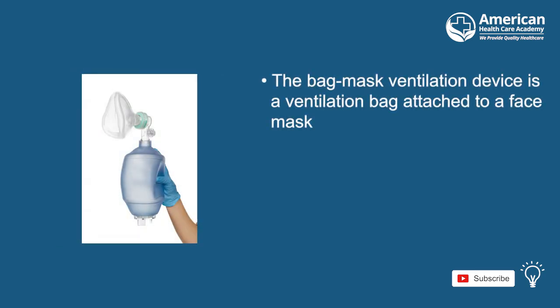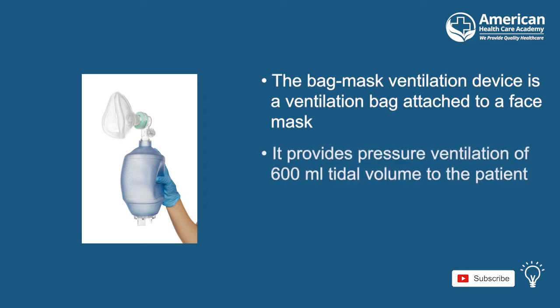For ventilation, the bag mask ventilation device, which is a ventilation bag attached to a face mask, can be used. It provides positive pressure ventilation of 600 milliliters tidal volume to the patient.